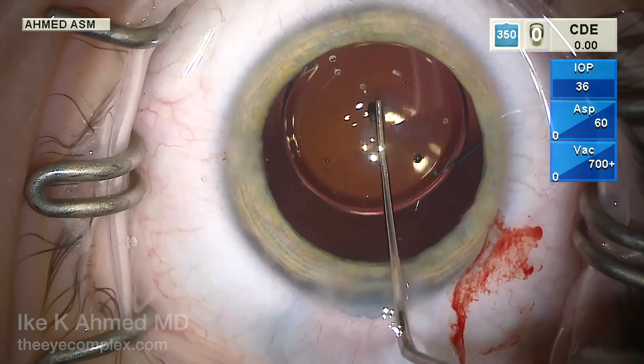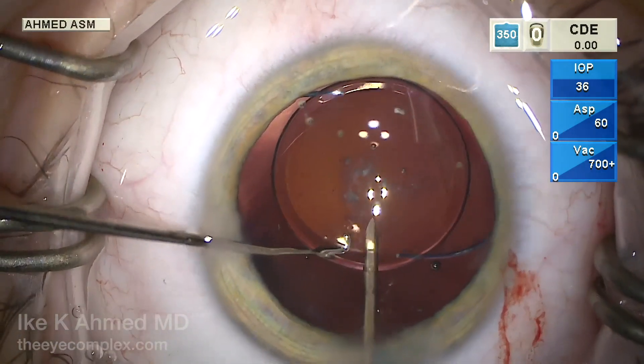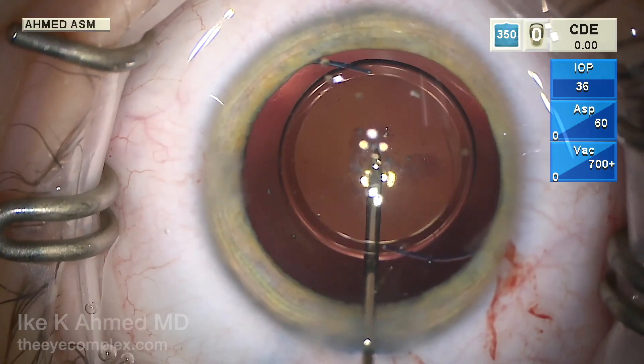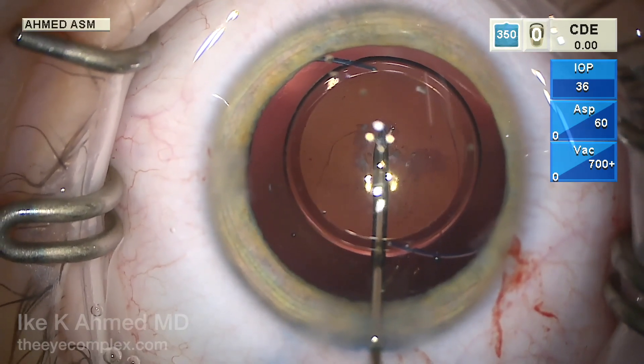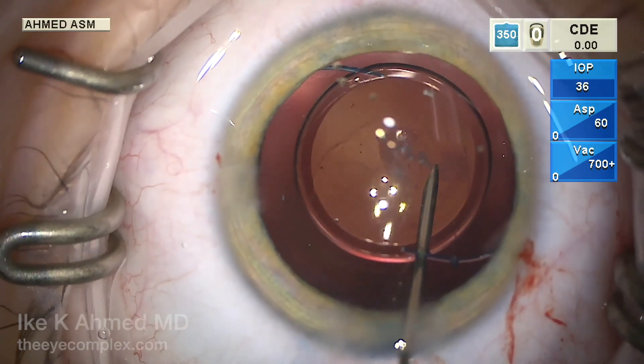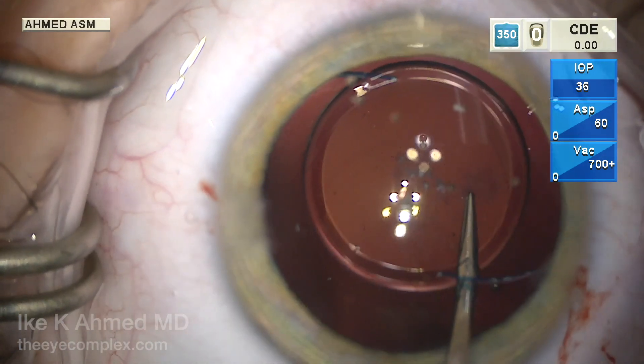The lens is nicely in the bag, and I like putting the IOL in first before doing the posterior rexis. Here we're using a 27-gauge needle with viscoelastic to puncture the posterior capsule, place the bevel into the Berger space, and inject cohesive viscoelastic. This will help keep the vitreous back while we do the posterior capsular rexis underneath the IOL.